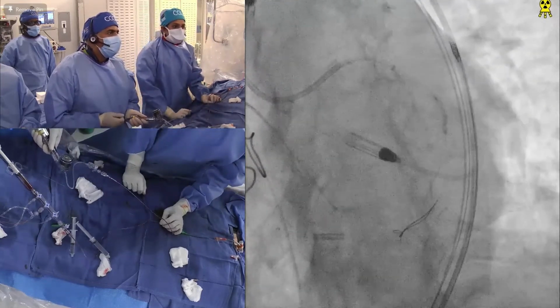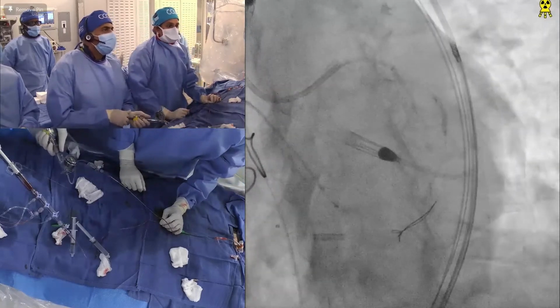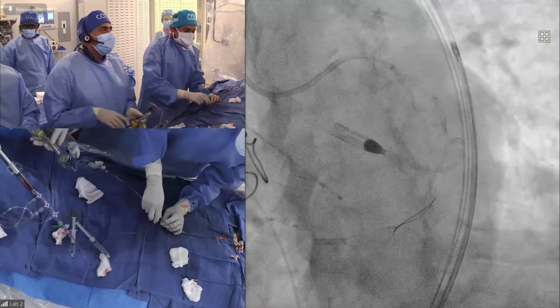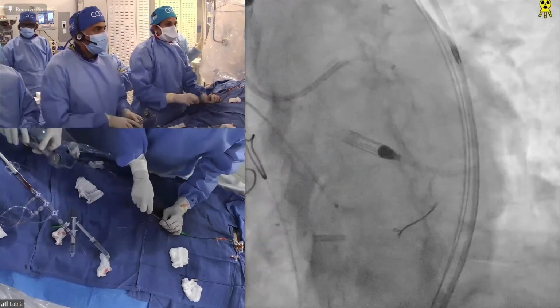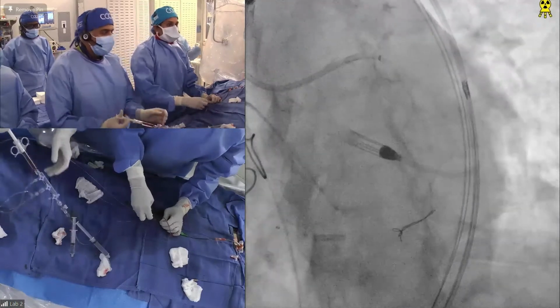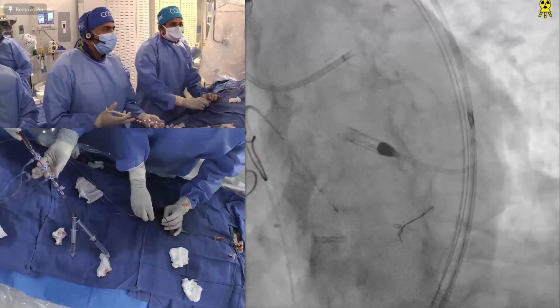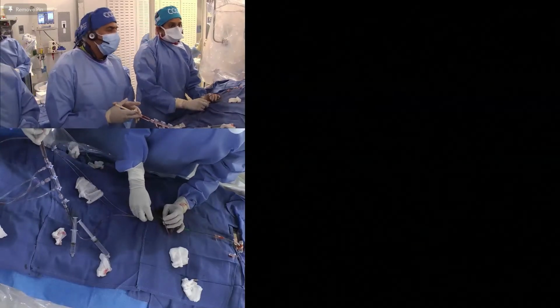So I think in this case, if you're okay, we can just show the picture. If it looks good, we can go to the other room to see how you did, and maybe to the third case, because we only have 11 minutes. This is our simple case. Yeah, no, I know. We'll finish it that way. My case was simple. We dilated with a 4-0. Fantastic. The lumen is probably 9 millimeters square.